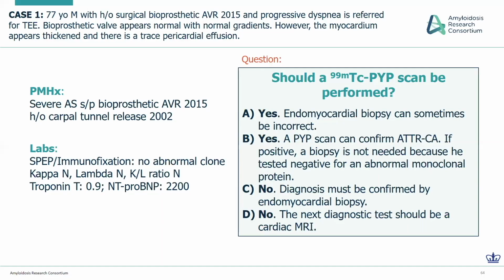So again, thanks, Sabi, for that excellent discussion. And I think to round things out, during the webinar, we're going to present a few cases in tag team. So we have a few cases to highlight some of the major important points. So here's case one. I'll turn it over to Dr. Bokhari. He can run through it.